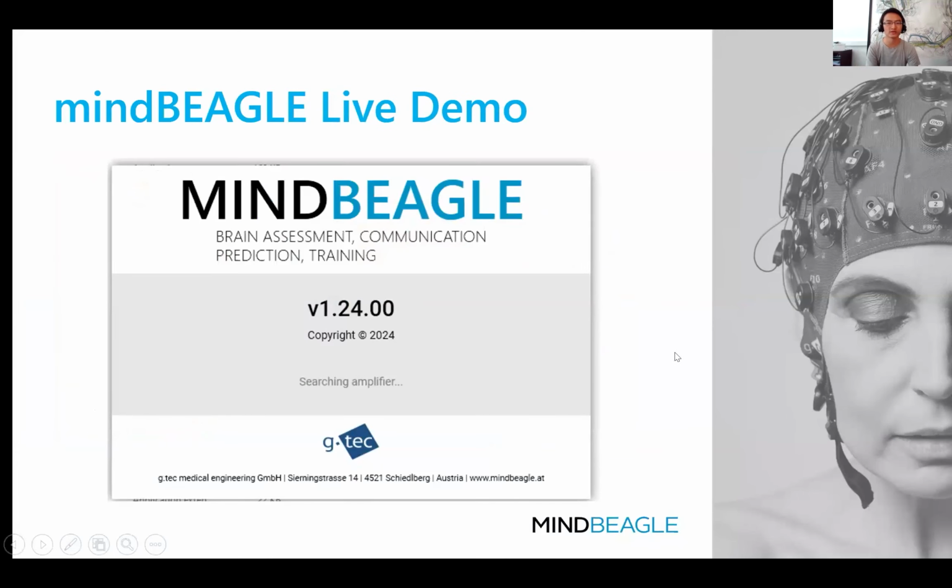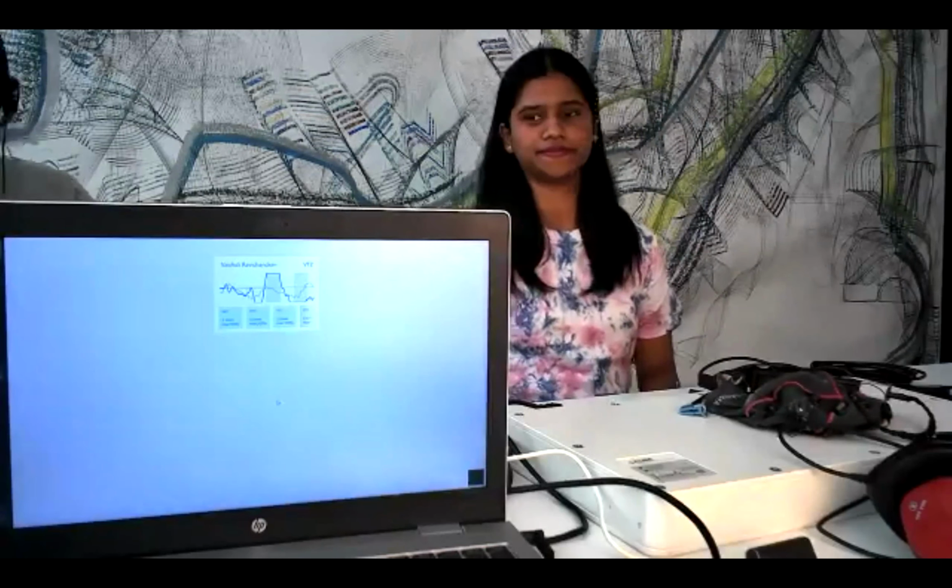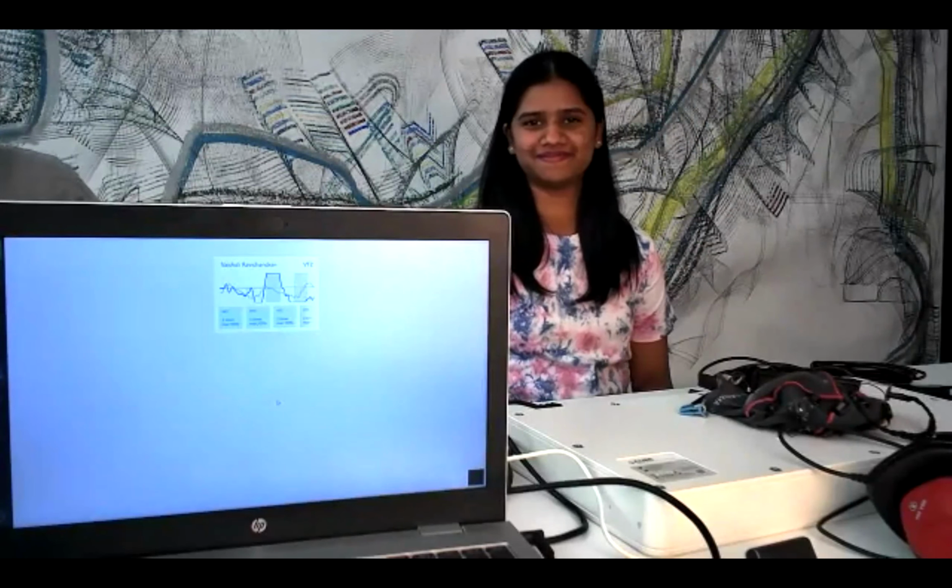Okay, I'm going to move to the live demo, and I'm going to invite my colleague Vaishali, and I'm also going to stop the sharing. Please exit here, and I'm also going to change the camera so you can see. Yeah, so you can see clearly Vaishali is here.